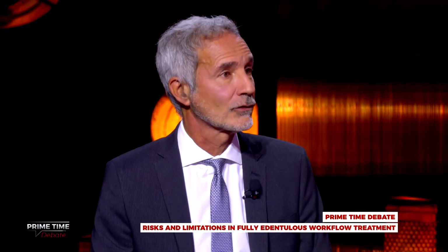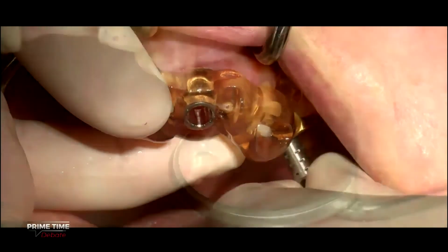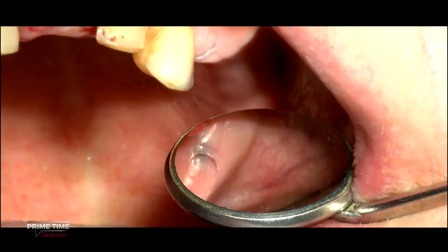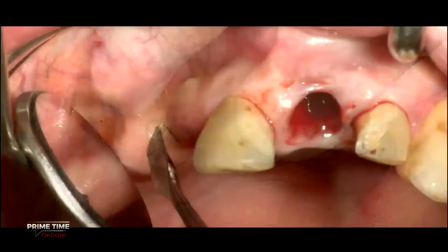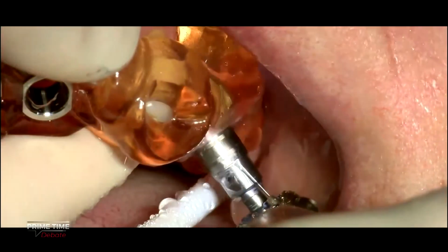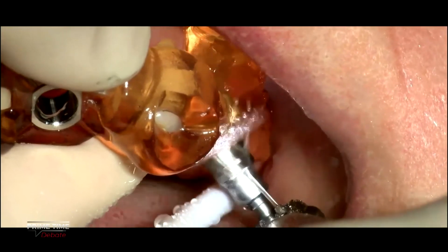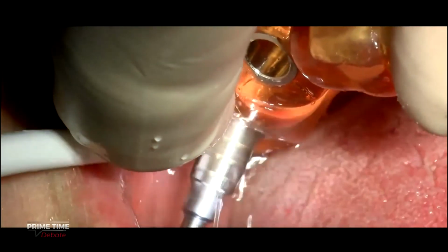In this case, you have to check very carefully the correct seat of the guide. Another important point is to understand if we can go on with the flapless approach or not. We need to understand if we are on the right track, so if the position is correct. In this case, it is not. Here in the posterior, we have enough keratinized gingiva, so we can punch on one side and the other side.